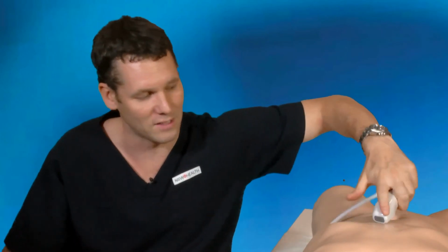provide enough pressure, so obviously you're not, again, trying to image their vertebrae, but providing enough pressure so that you can hold that probe flat and image up underneath that rib cage, making sure that you are not imaging off axis. And other than that, it just takes a little bit of practice, and it's frustrating to begin with, and the images are never exactly as they appear in the books, and that's unfortunately the ball game. But it does get better with practice.